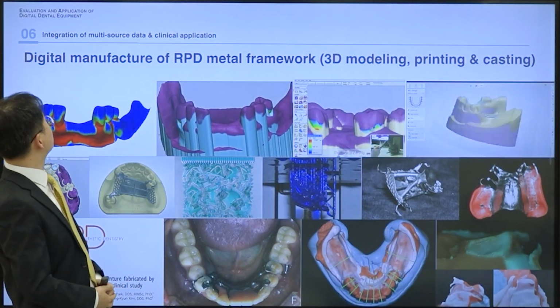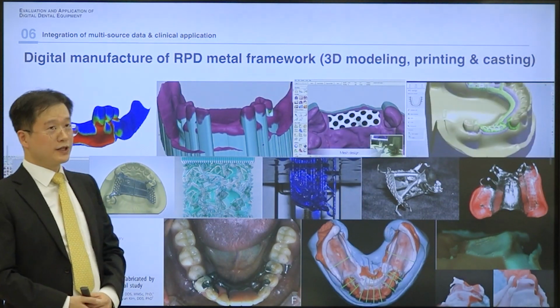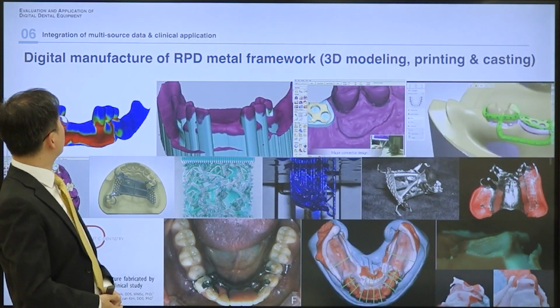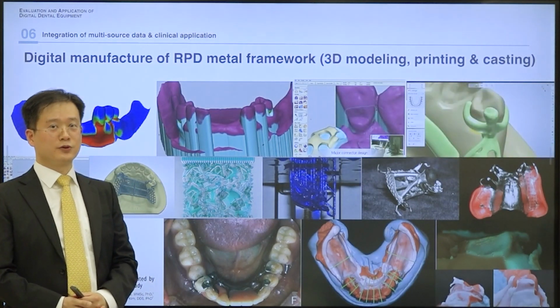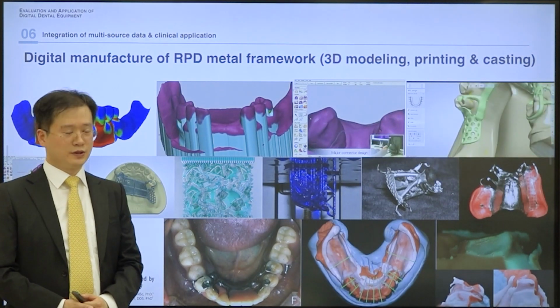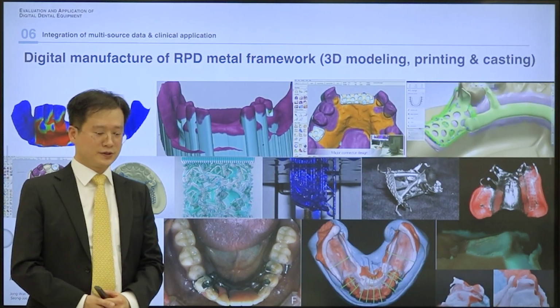And on lesson 6, integration of multi-source data and clinical application, I can show you how we can combine all those data to design and manufacture restorations such as crowns and dentures.